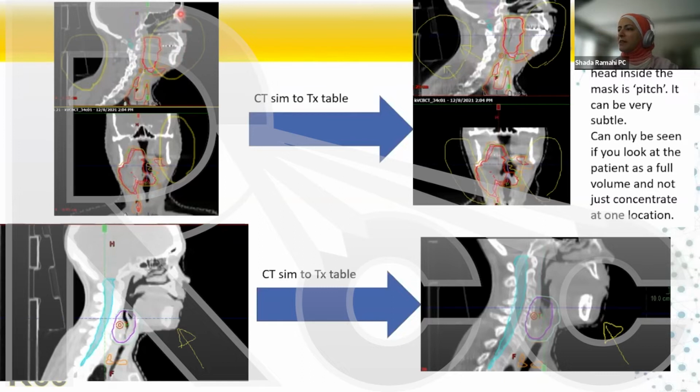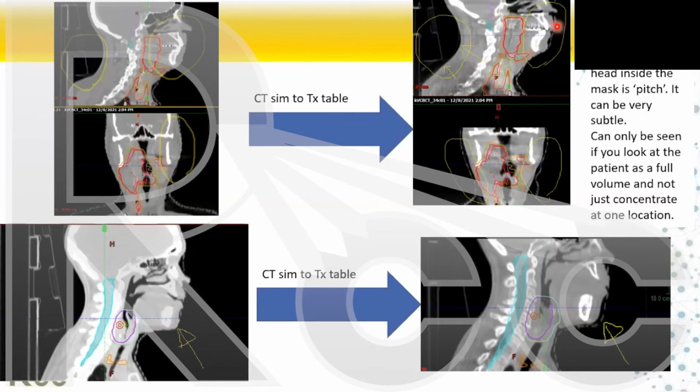You can definitely see the outline of the mask being nicely attached to the patient. And here you can see the outline of the mask. It's loose. Now remember this, if you look at me, this thing is a pitch.